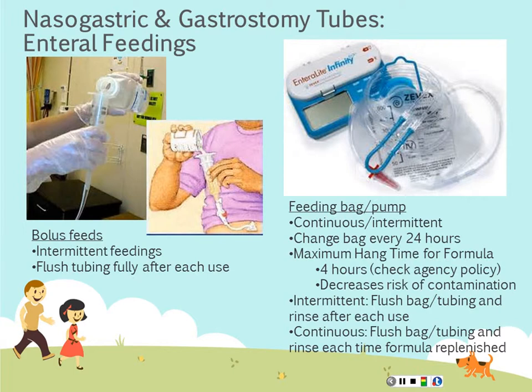The issue with that is you've got a direct pour into the stomach. Any pressure or stuff like that can make it come back on you. So if the patient starts to cough or something like that, all of their gastric secretions and the formula you just put in there can come back up and you could be wearing it.